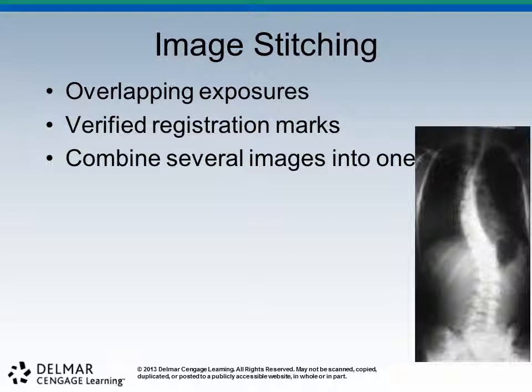These are typically 30, no, what are they? 35 centimeters wide and gosh, 70 long, I think. Sykeston has this capability down there. I don't know if anybody else does or doesn't, but then all those images are stitched together in a nice seamless way. It's great for the patient because we can make three different exposures that are appropriate to the part thickness and then save our patient dose.